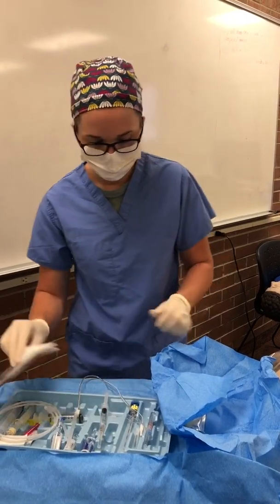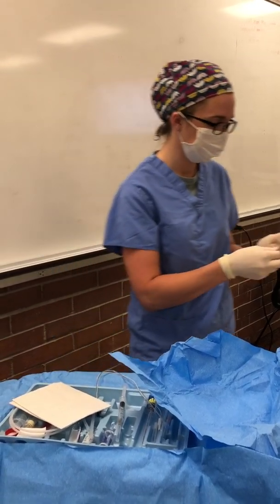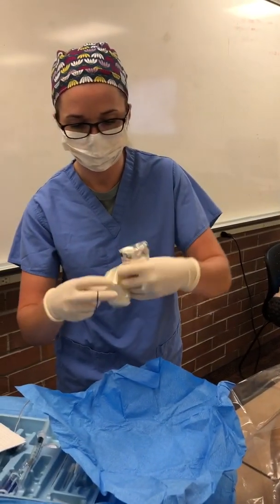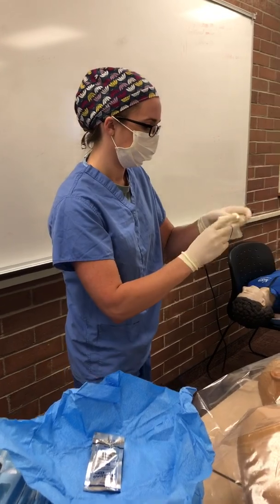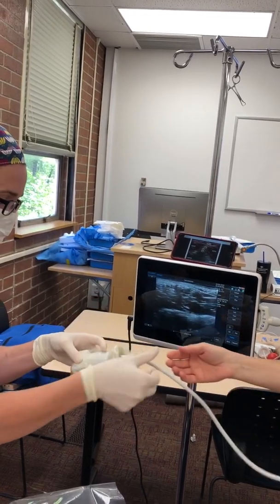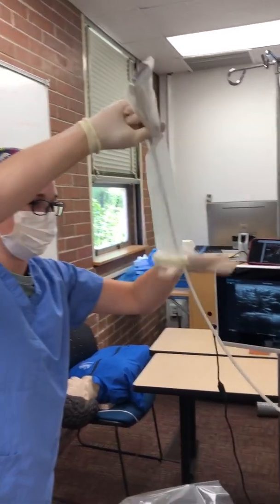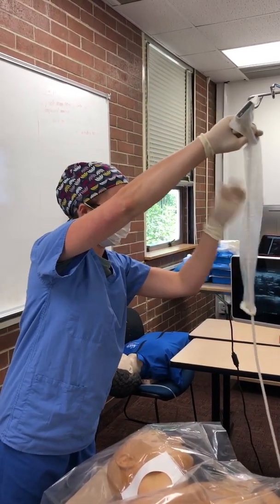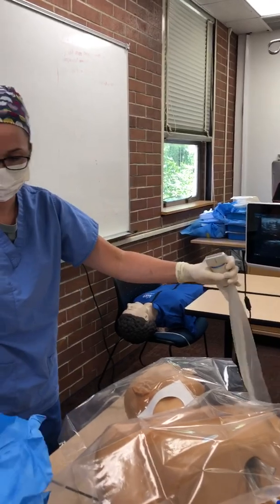And, all right. So I do have my sterile probe cover and sterile gel for this, so I can put a little bit on that site right now, and if I wanted, I could put a little bit inside my probe cover as well. So I'll have you drop that in. Obviously, we would have a nice fresh one in real practice, so we'll say that this smoothly slid down. If you don't mind just grabbing the end. And again, if I wanted, I could put a little more sterile gel on the end here.